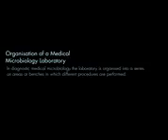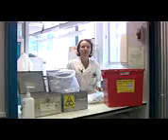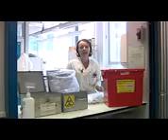This is the microbiology laboratory. This is specimen reception. Here all the samples come from various hospitals within the trust and other users of the service.